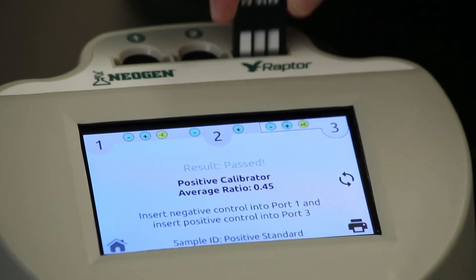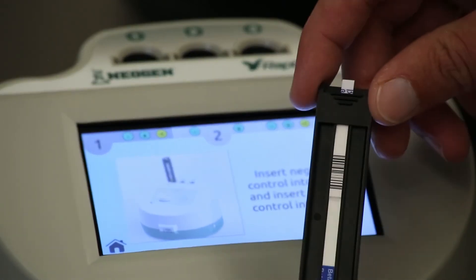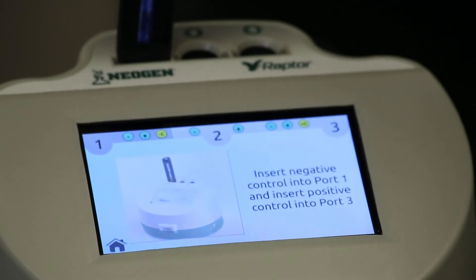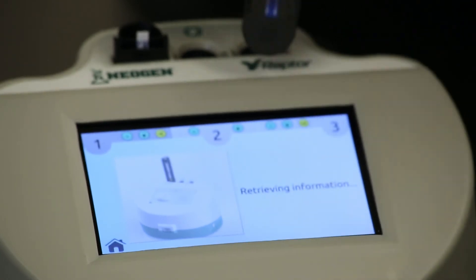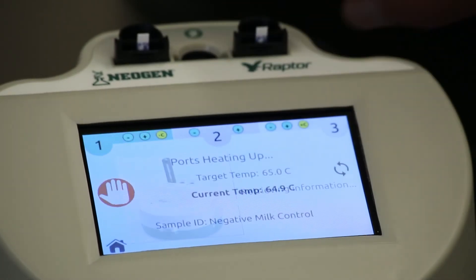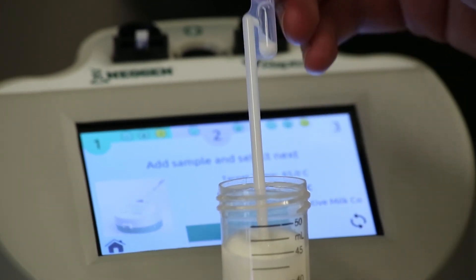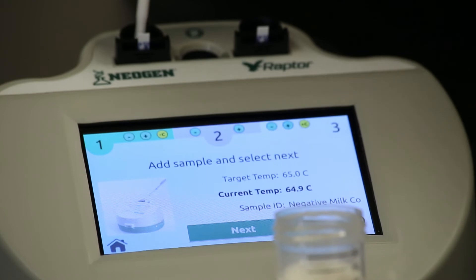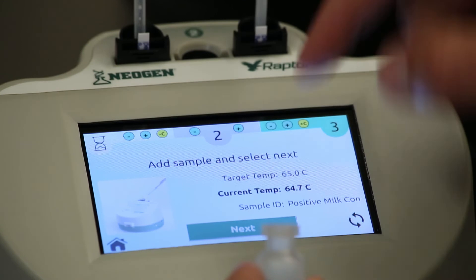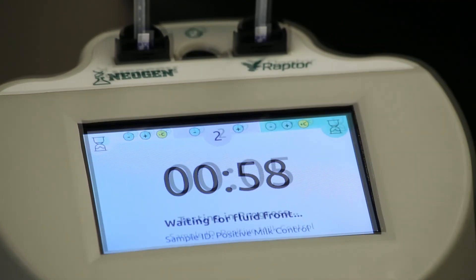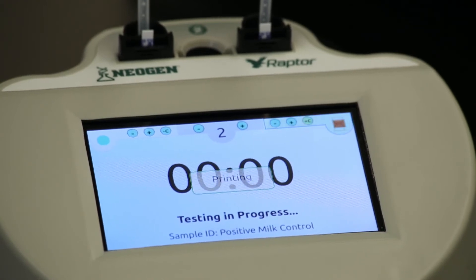With the reader's ability to distinguish between a positive and negative result established, continue to follow the on-screen prompts to run the negative and positive control to ensure the particular lot performs as expected with a known positive and negative sample. Only one negative and one positive test needs to be performed, as this is an assessment of kit lot performance. When you receive a brand new kit lot, this assessment must also be performed using positive and negative controls. After the controls are complete, a daily control summary will appear on the screen and will also be printed.